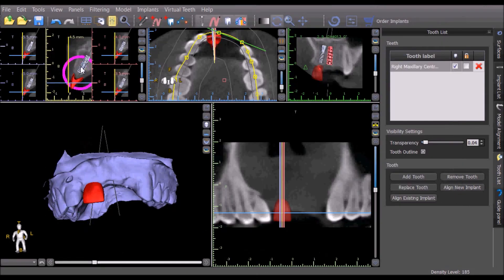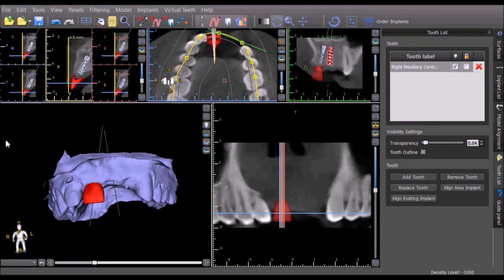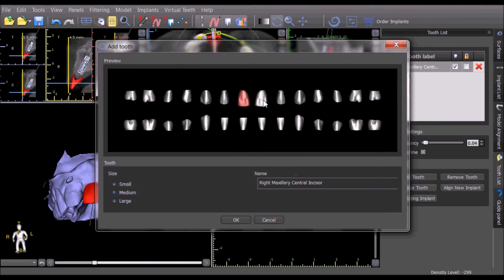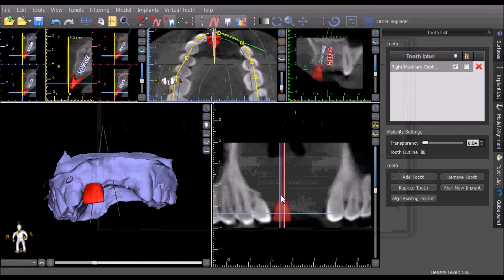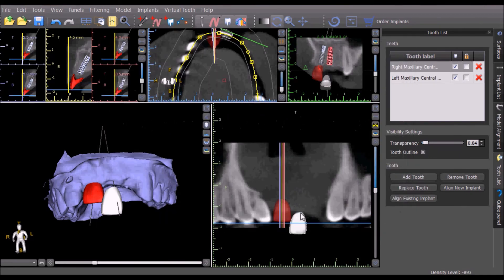The new implant will be inserted automatically. Additional teeth can be chosen and inserted as desired.